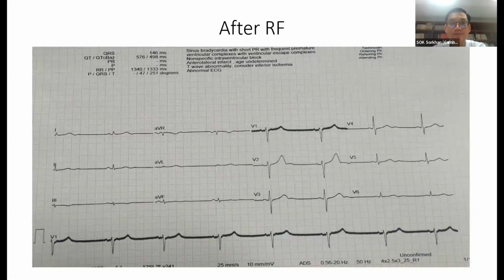Okay, so my slide presentation is finished here. So we did 2 ablations in the same patient, 2 times. Do you have any comments or anything else?